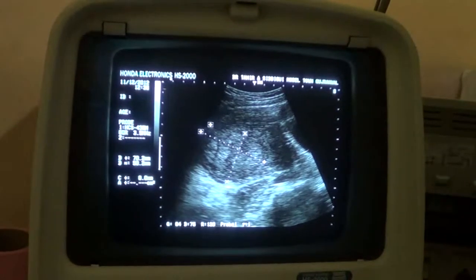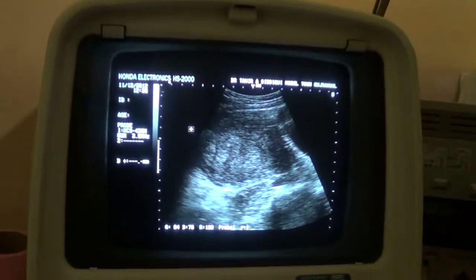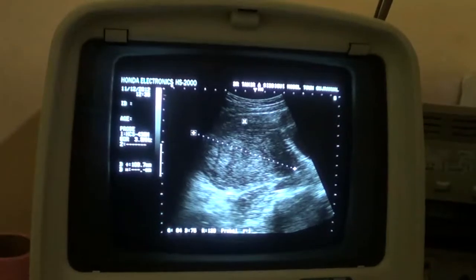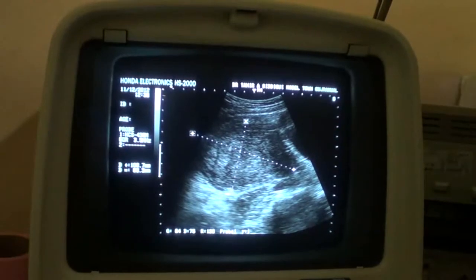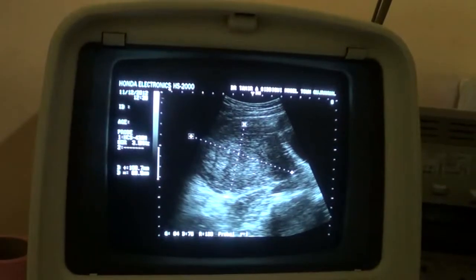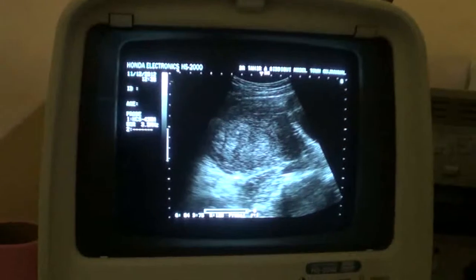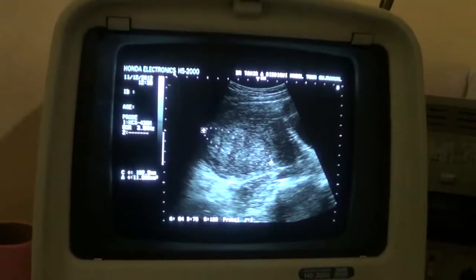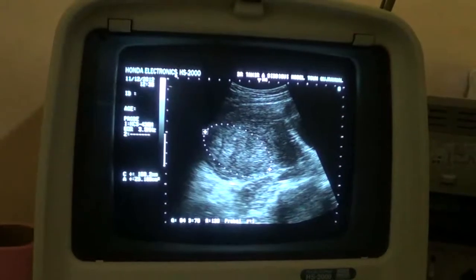And if you see the uterus as such, the uterus measures 10.8 to 6.9 centimeters. Now this anterior posterior diameter is in line, should not exceed more than 5. It's because of this fibroid extending from the fundal region into the posterior uterine wall.